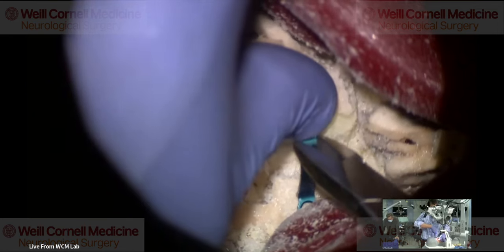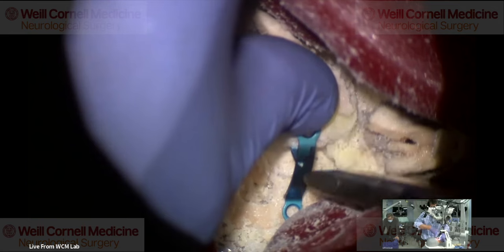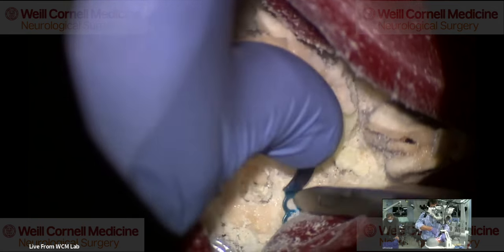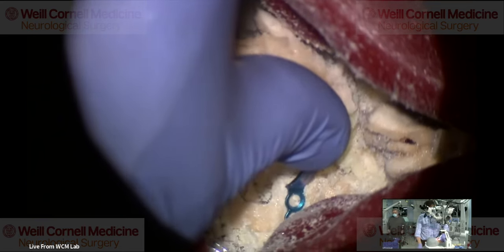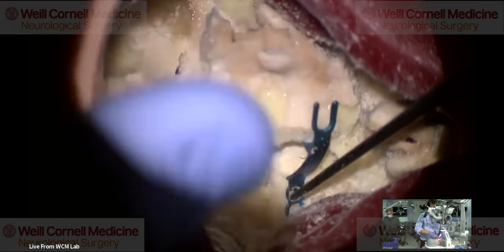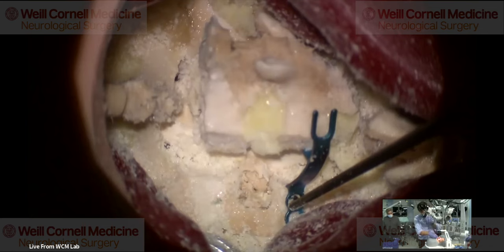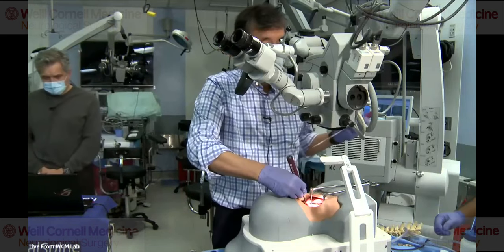So then you just slide that under. They have two different throat sizes, one small and one large, so that if the lamina is thick, you use the larger one, and if it's thin, you use the smaller one. So then I do that, and I hold that in place, typically with my thumb and maybe a little curette like that. Then I have the fellow come in with a little burr and they notch that little thing. Now we don't have a small burr, but we do have a little drill that is a manual drill.